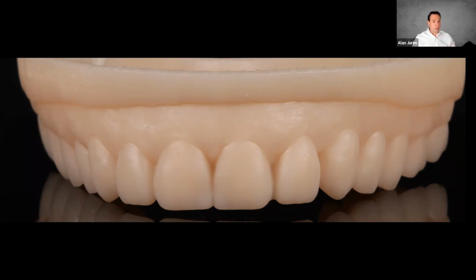And this is a really powerful part of the type of digital dentistry that we do, because whereas traditional wax-ups were done using more traditional techniques, digital tooth setups and digital wax-ups can really optimize the process of designing a smile, because we can almost design a smile in a patient's dental facial profile. So digital wax-ups are by far one of my favorite workflows and favorite tools that we have in digital dentistry.